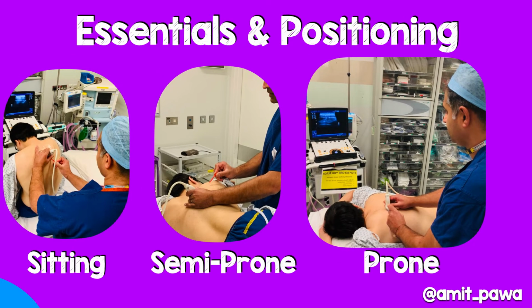So when I first started doing the block, as you'd see here, I used to do it with the patient in the sitting position, and that was fine for the majority of blocks, certainly for blocks that didn't take time. But after a while, the practitioner can get fatigued, especially when the arm is away from the body or when you're holding your arms up at shoulder height. So I then moved to taking the patients into the semi-prone position.